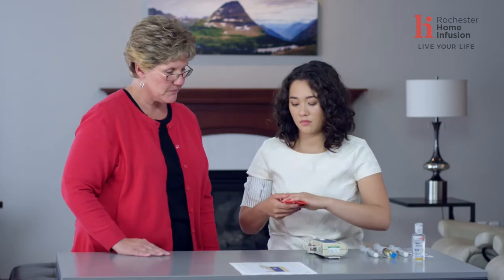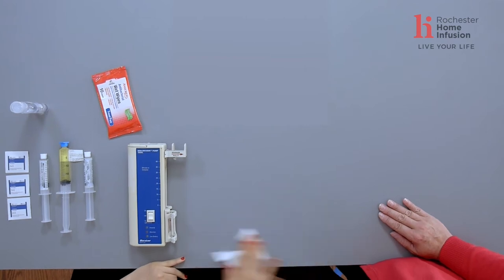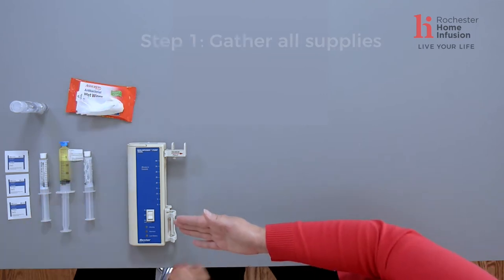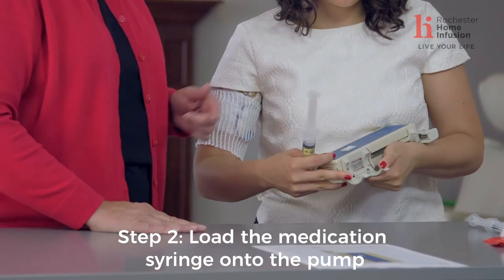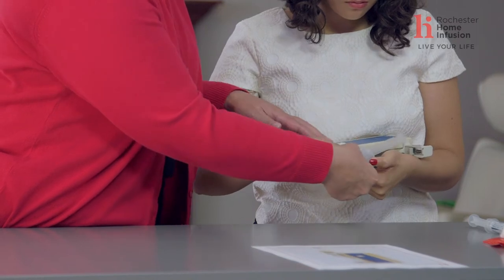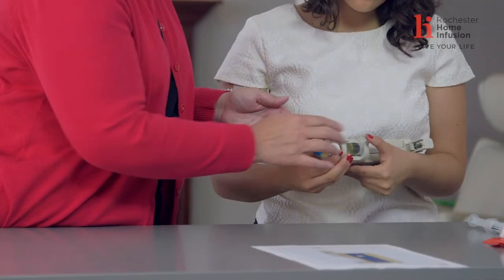The first thing we want to do is clean off our surface. Now we have all of our supplies gathered. I like to take my pump and my syringe of medication and put the syringe into the pump. You're going to hold the pump in your arm and put the barrel of the syringe into this clasp — there are arrows on the pump itself showing you how to do it.